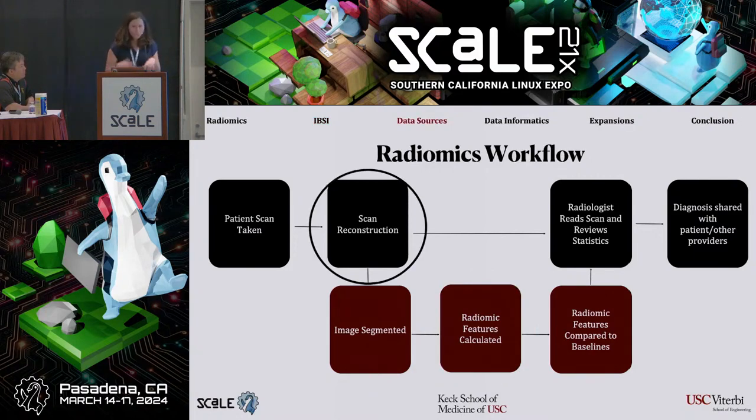So when we're trying to generate these models and figure out these radiomic baselines, there's a problem in that radiology has been a qualitative field for a long time, and most of the engineering tools that have been generated have been focused on clarifying the individual images. We're trying to engineer better scanners. We're trying to create finer details so a radiologist can look at it clearer. But those filters that are applied and those processing techniques obfuscate that raw data.